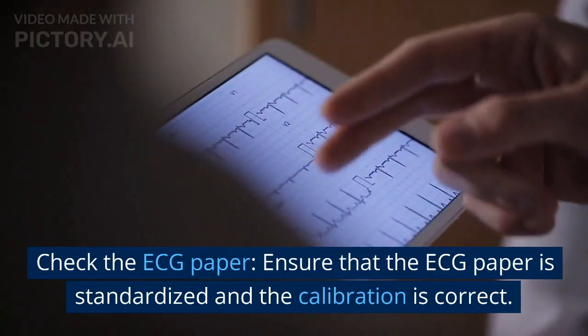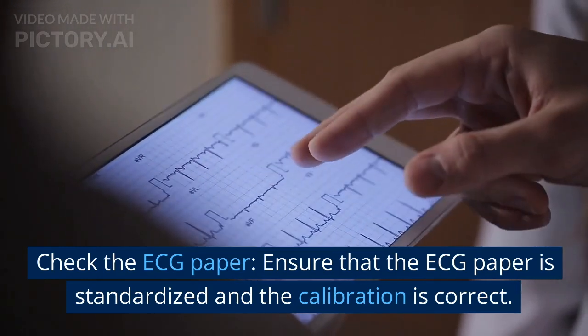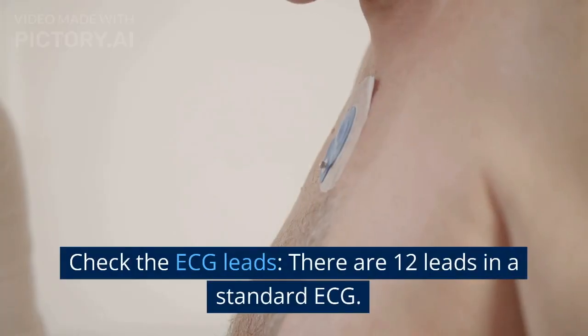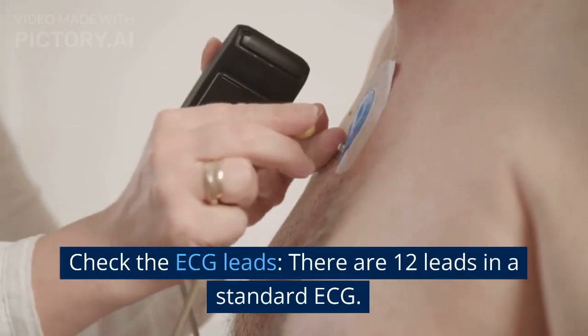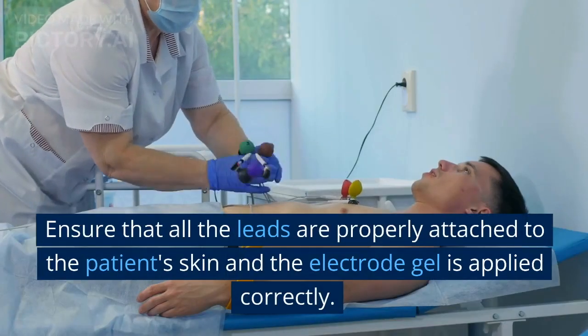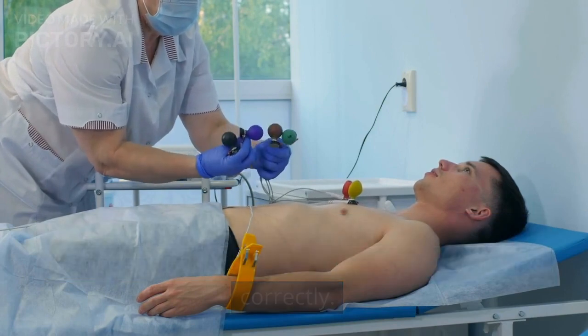2. Check the ECG paper. Ensure that the ECG paper is standardized and the calibration is correct. 3. Check the ECG leads. There are 12 leads in a standard ECG. Ensure that all the leads are properly attached to the patient's skin and the electrode gel is applied correctly.